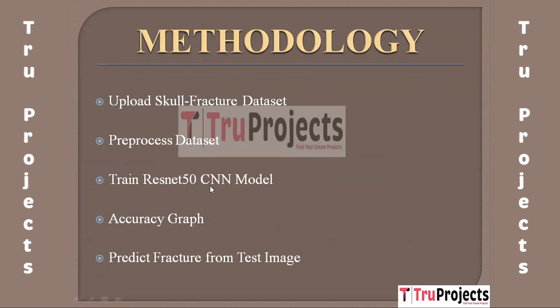The third module is Train ResNet 50 CNN model. Using this module, we will train ResNet 50 transfer learning with CNN by using the above train and test data and then build a prediction model. Convolutional neural network is a deep learning algorithm specialized in image processing. CNNs identify patterns, edges, and features in CT scan images to detect fractures accurately. Transfer learning leveraging a pre-trained ResNet 50 model enables the CNN to inherit knowledge from non-medical images, improving fracture detection accuracy with limited CT scan data.